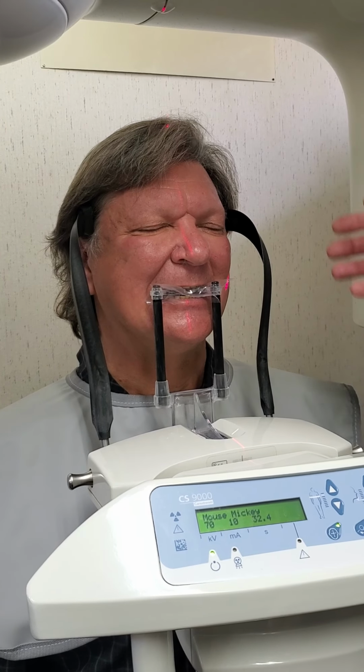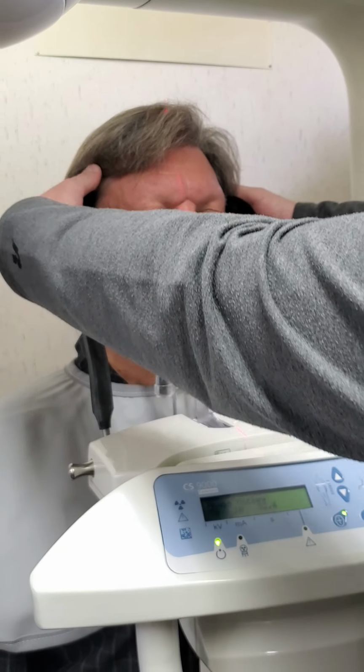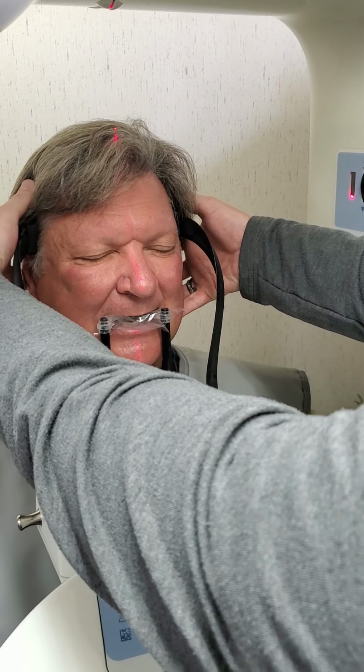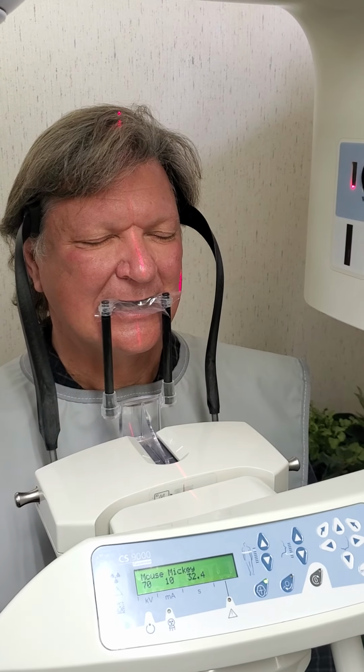You can have your patient close their eyes. Go ahead and close your eyes. And you can pull up your laser positioner, and we'll notice that this line is just off center a little bit. So we can turn our patient's head that way. Now you can see that line runs right down the middle.